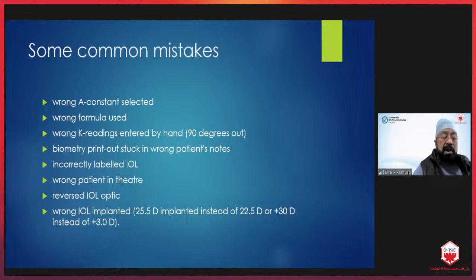Then incorrectly labeled IOL. I had a problem in one case where the label was incorrect. Then the wrong patient is brought into the operation theater. And sometimes there's a reverse IOL optic, especially with the three-piece, multi-piece IOL. While injecting, the leading haptic opens with a jerk, and sometimes you push it and it is upside down. So that is going to create a problem.